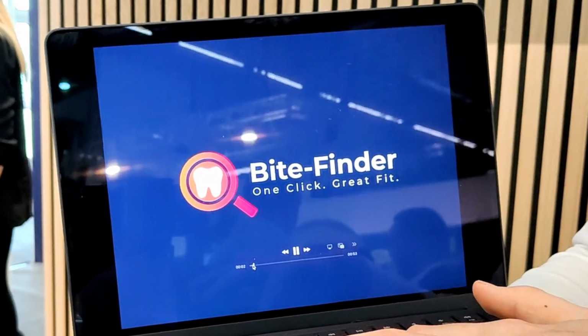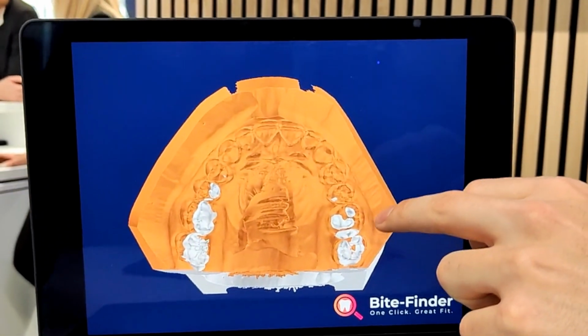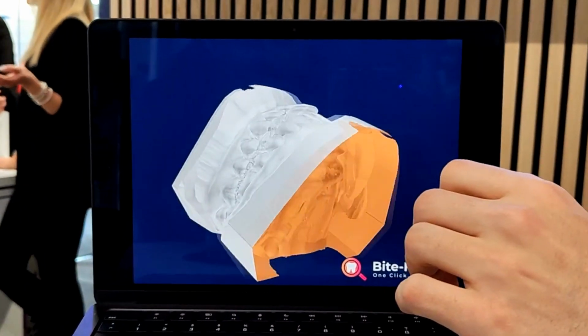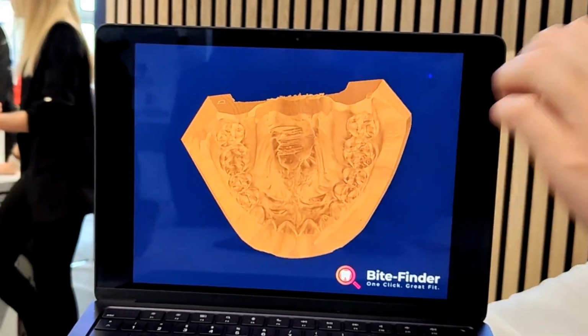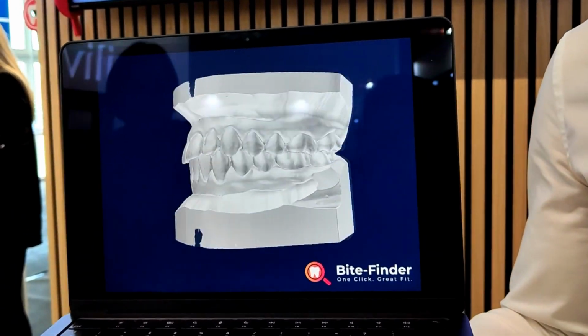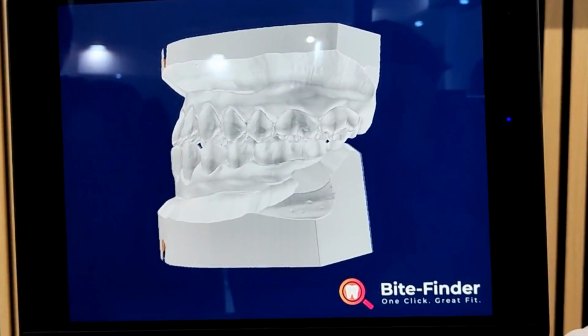Let me quickly pause you here on the penetration. That's the biggest issue of intraoral scanners. Yes, they will create penetration. Totally agree. Not possible. What we do now is, by one click, we give you the occlusion you want without penetrations, with contact, because that's the only thing that is possible. The next biggest thing, because it's based on a perfect static occlusion, is a dynamic occlusion. You can visualize it, you can show it to patients, to the dentist, and also for documentation, you can place it in the folder where everything else is.